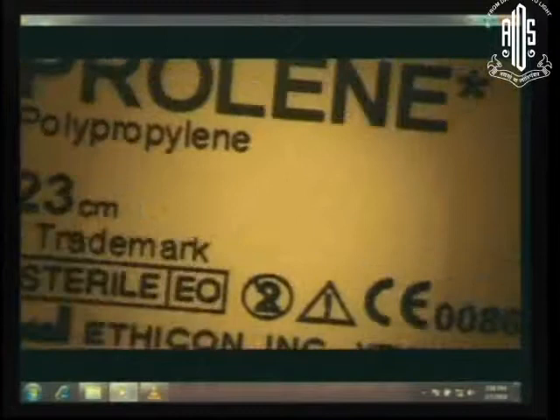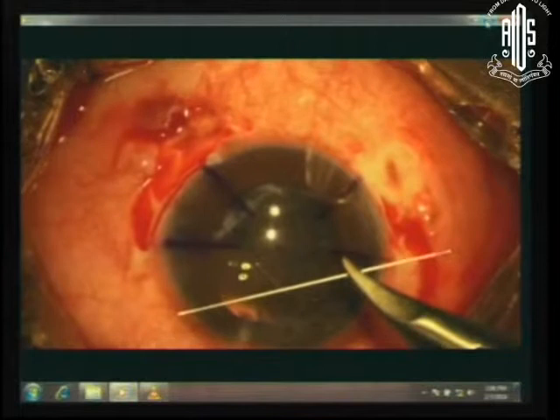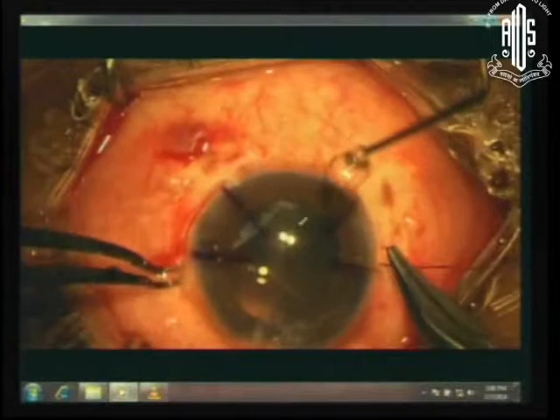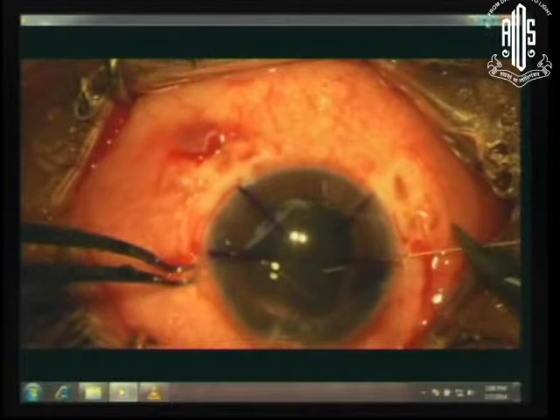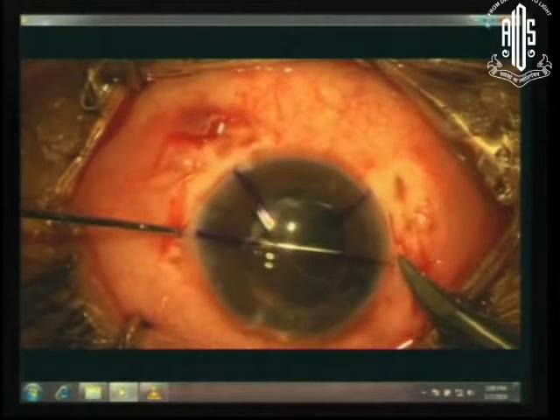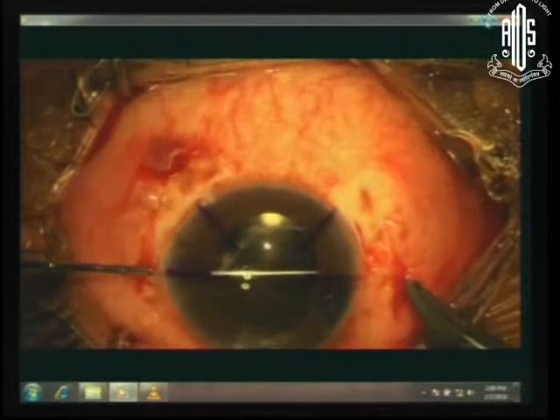This is a standard suture W1713 — that's the code number which we utilize. All we now need to do is insert this needle in a manner in which it goes to the other side. Insertion at the first place where we have made the first incision, under the iris supporting the cornea, and from the other side we insert a 25-gauge needle through which we feed in the suture. The needle enters easily, and when the 25-gauge needle is removed, it comes out.